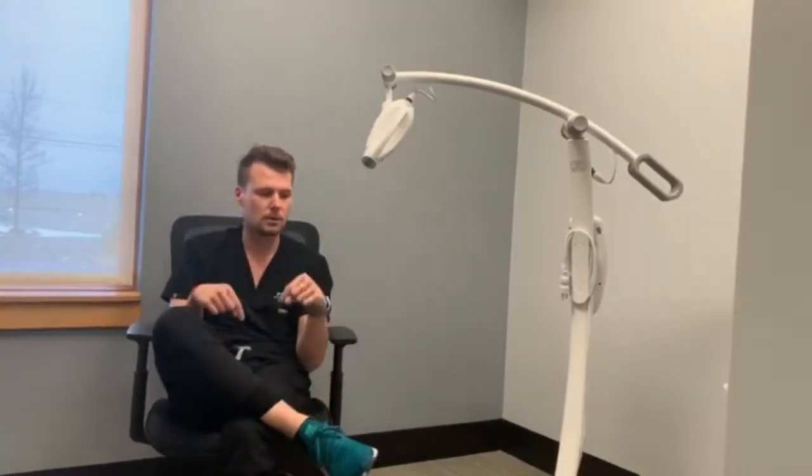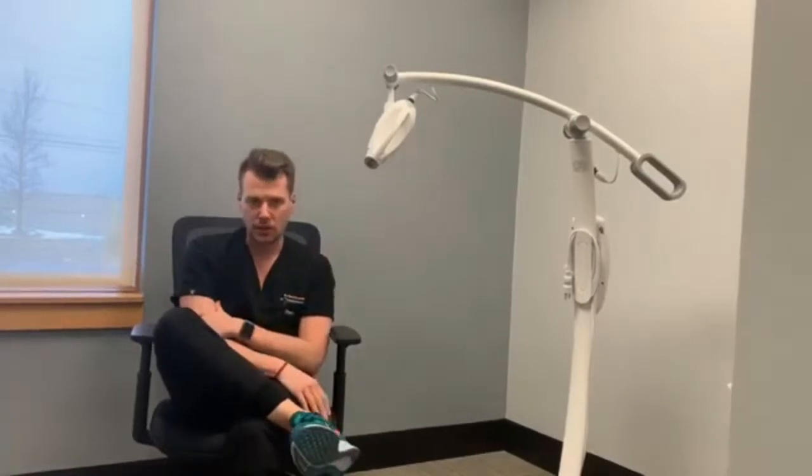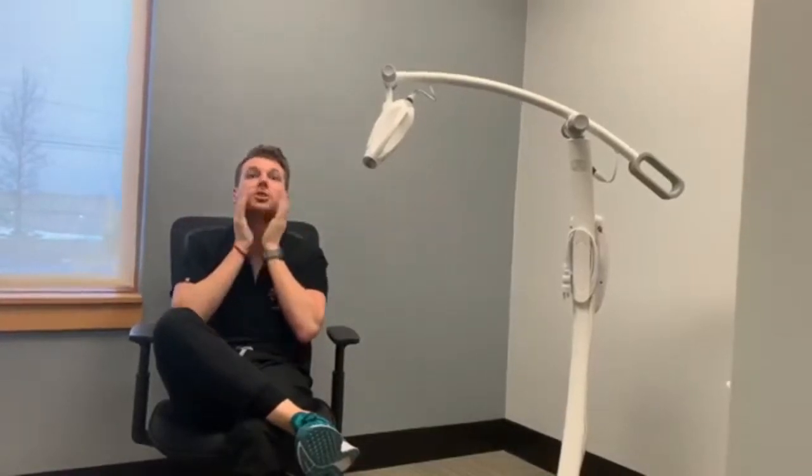The fourth and final question is: what can I expect of the bleaching procedure? First, we're going to get you seated and comfortable, reclining at a 30-degree angle. We like to use a full cheek retractor so everything is pushed away. We'll take a before photo and document your pre-op shade so we can compare it to the end result.